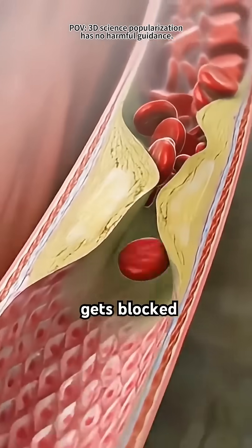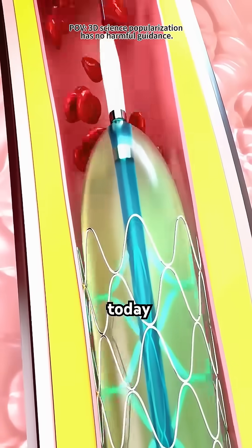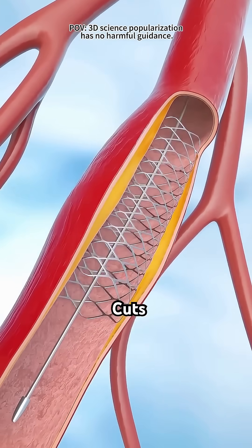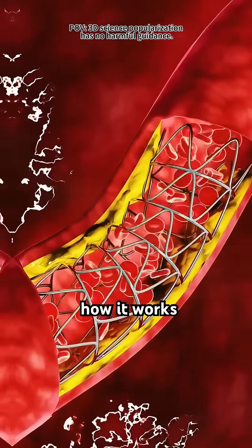Did you know that when a heart artery gets blocked, you don't necessarily need open-heart surgery to fix it? Doctors today have a much smarter solution: angioplasty. It's a minimally invasive procedure, which means no large cuts, just a tiny opening that helps restore blood flow. Here's how it works.